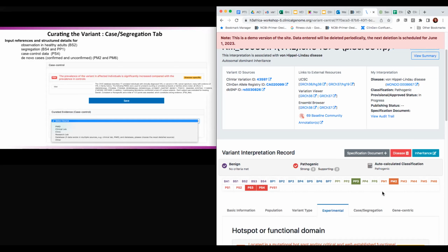Great. So yes, for time, this is all the codes I'm going to add in. There are several more codes. Again, this was a very well-established pathogenic variant. There's no question that it's pathogenic. But I won't add in all of the other codes now. We've already gotten to pathogenic so far.